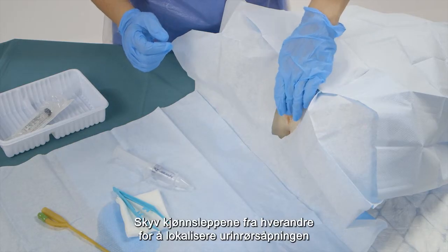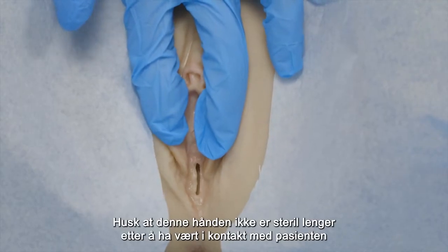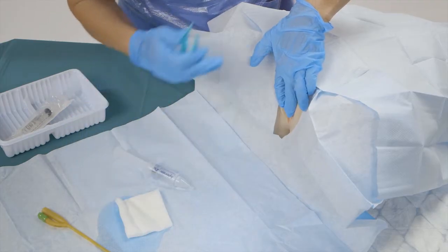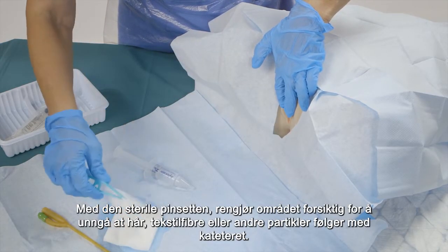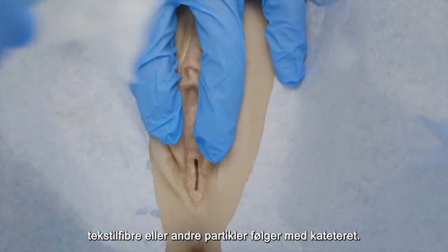Separate the labia minora so you can localize the urethra. Remember that this hand is not sterile anymore after touching the patient. Using your sterile forceps, carefully clean the area to avoid any hairs, textile fibers, or other particles entering with the catheter.